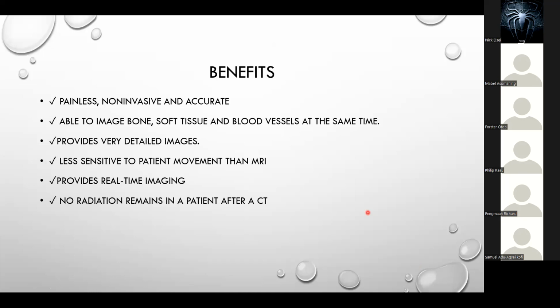All right, so what are some of the benefits? Benefits include that it is painless, non-invasive and very accurate. It is also able to image bone, soft tissue, and blood vessels all at the same time, so with that one image you're able to take all of that. And it provides very detailed images.